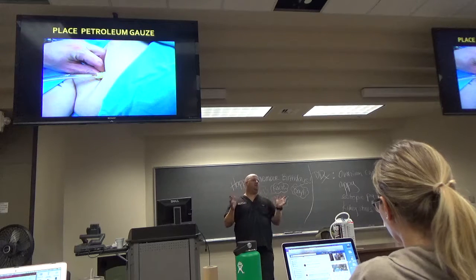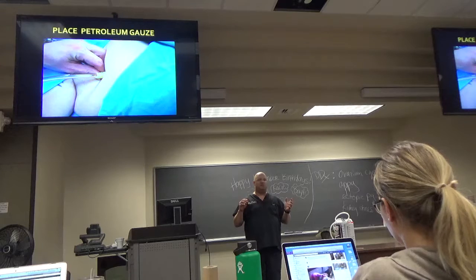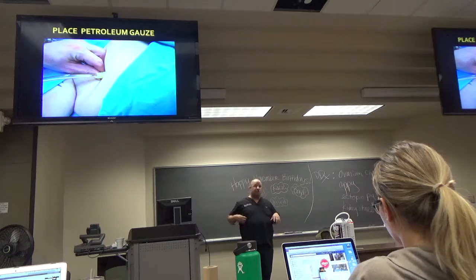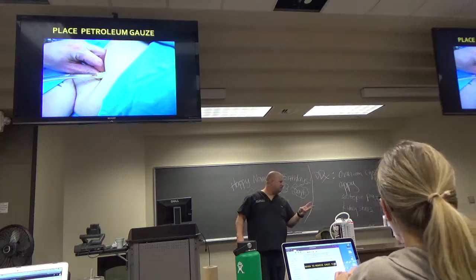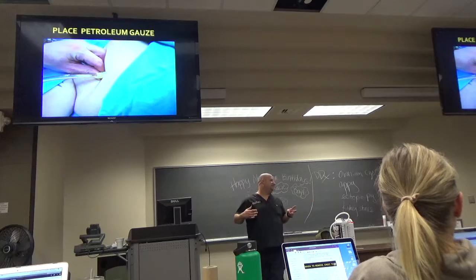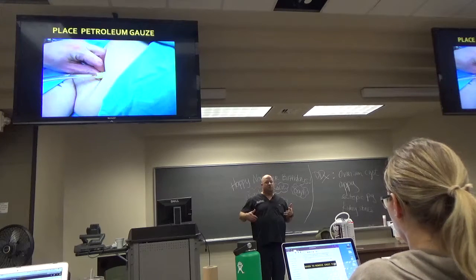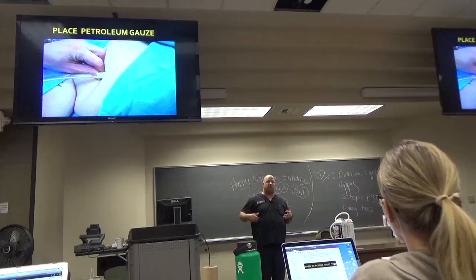But what we want you guys to do tomorrow is we're there all day, okay? Now obviously not everybody's going to have the fourth and fifth intercostal space, anterior axillary line. We're going to be poking holes all over these cadavers. There's three cadavers again, right? We've always done three in the past. I assume it was three. Obviously, we're going to have to move around, but again, you're going to get what it feels like to make the incision, to poke through the lungs and all kind of stuff.